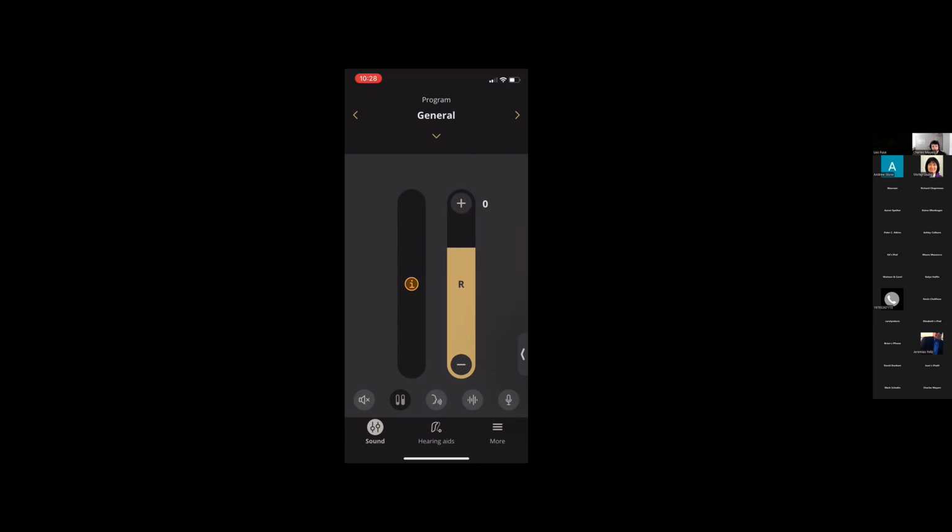So it's important to remember that in order to get the best use of your hearing aids, you should make sure that you're getting consistent hearing tests. That is important because it dictates how effective the prescription that you have set for your hearing aids is.